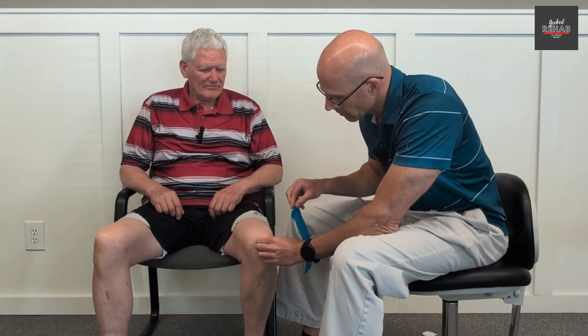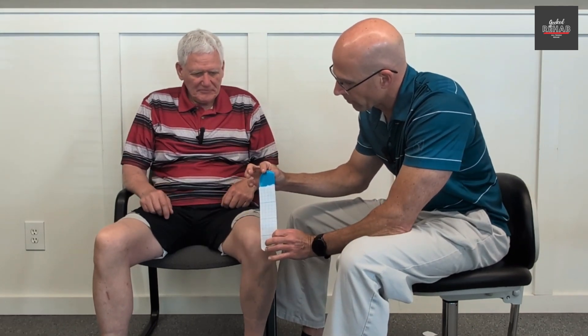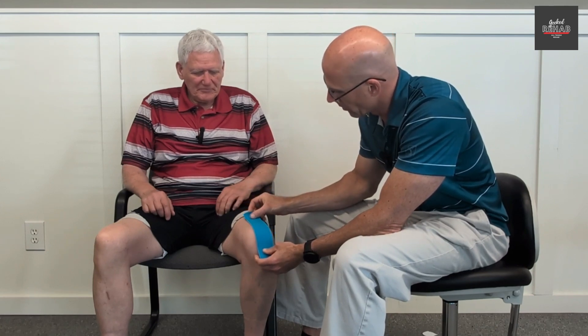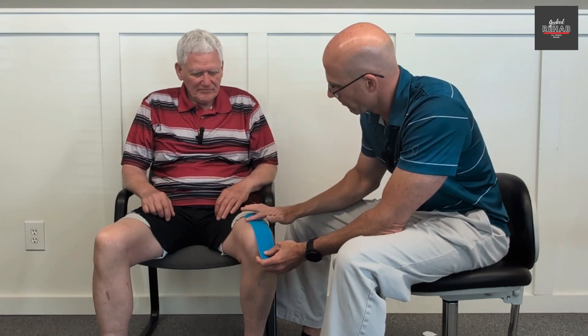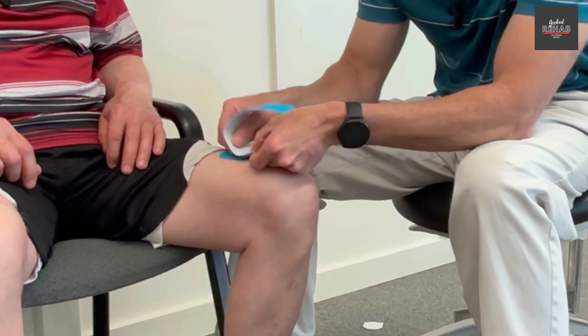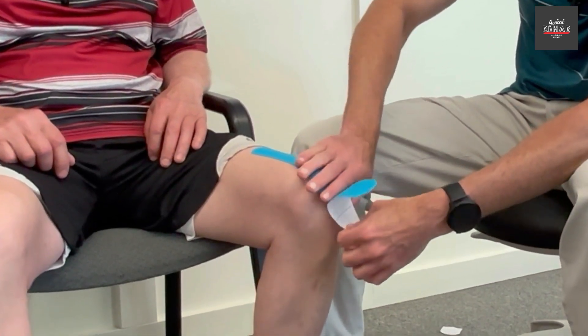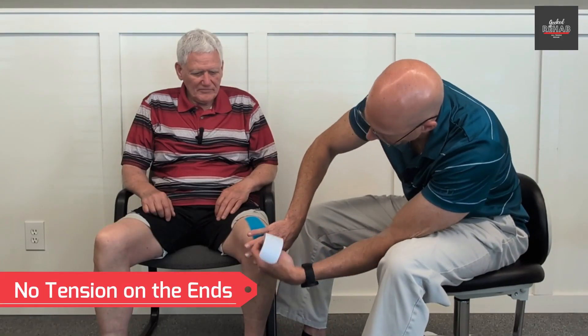If you have too much tension and you straighten your leg it'll be kind of flat, but if you do this right and you straighten your leg there's going to be a lot of wrinkles in there — that's pulling away on the skin and the pressure and causing some decompression. That's when you know you got it right. So we look at where the kneecap is, you want to go right along parallel to it. I take about an inch off and put that down with no tension, and as I pull the paper off I go over it with my hand to lay it down at that 10%, and at the end there's no tension and I lay that down.